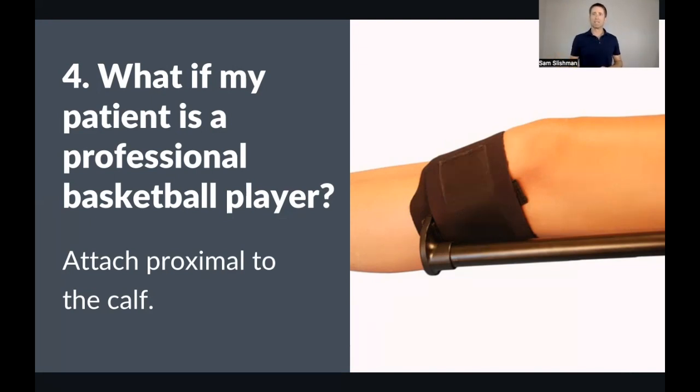Nobody's ever said there was any kind of nerve injury from applying any of these splints. I can see if you don't give rotational stability, then perhaps rotating out and having this end cap pushing directly on that superficial peroneal nerve, maybe something could happen, but I think the risk is exquisitely low. That is a long answer to the question. If you have a tall person, apply it proximal to the calf if needed.